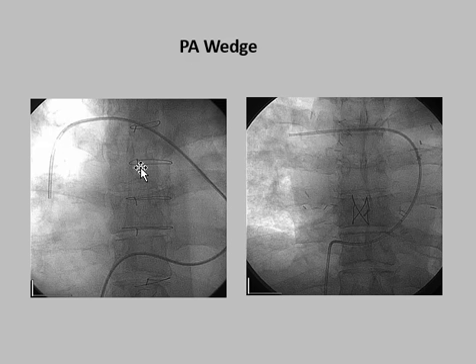Pulmonary artery wedge position with a Cournand catheter. You can see there's no balloon there or here, although that could be misleading, but take it from me, it's artifact, that little bubbly appearance. And you can see it's wedged reasonably far in, and when these pictures were taken, it wasn't bouncing around. So take it from me, it was a stationary wedge position with a Cournand.